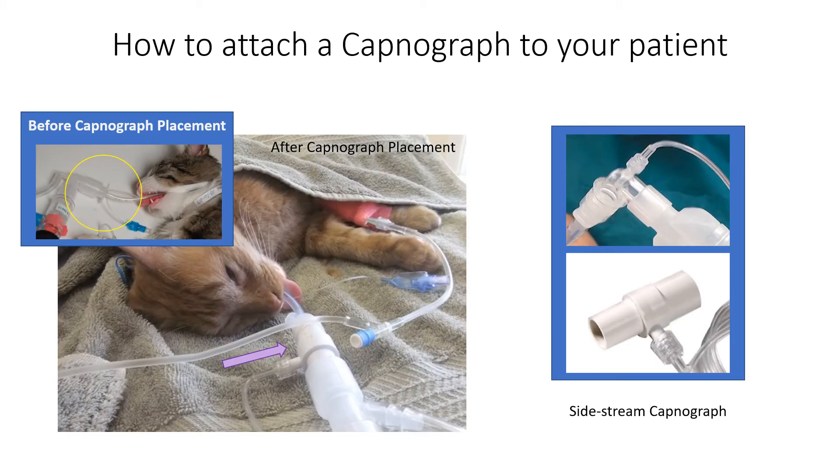We just finished reviewing a mainstream capnograph attachment. This is a sidestream capnograph. As you can see, this is a smaller, lighter attachment. There are other differences that we'll discuss in a later lesson. The sidestream only fits one direction, same as the mainstream we just saw.